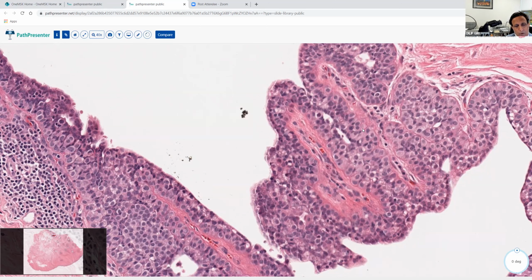Often that may not be a problem. Why? Because DCIS will look very abnormal, right? I mean, cytologically, the DCIS cells will stand out, and we will have no difficulty in making the diagnosis. Yeah, this is DCIS, which is spreading in a Pagetoid fashion.